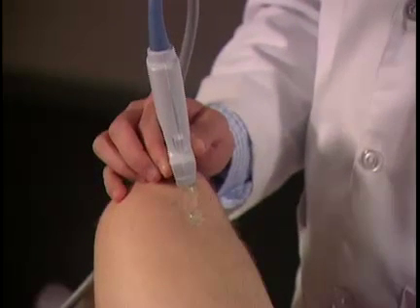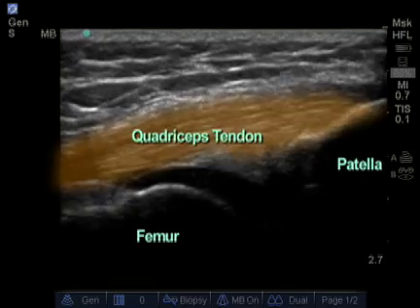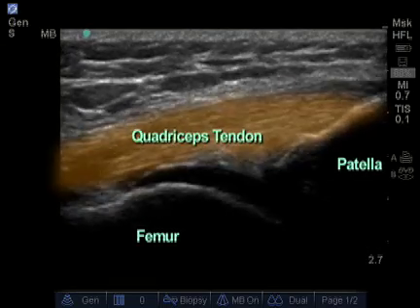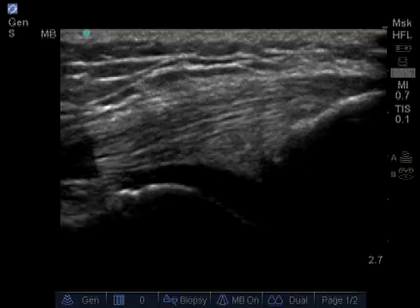I'm going to scan up and down the quadricep to detect any abnormality. Clinically, if I suspected a tear more proximally, I would examine further, but for most purposes, this is sufficient.